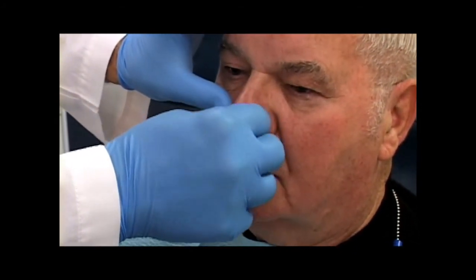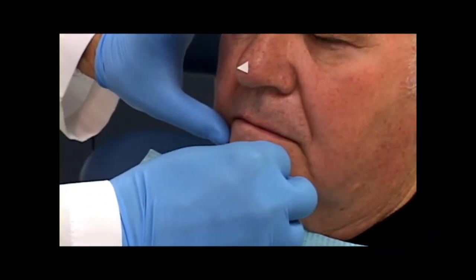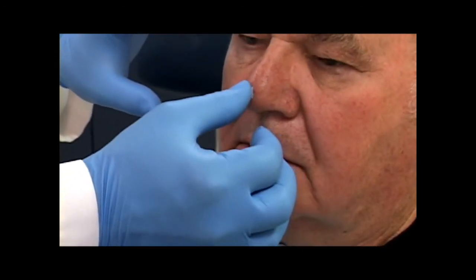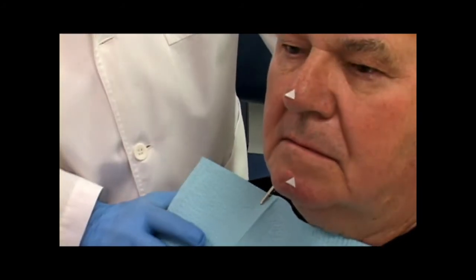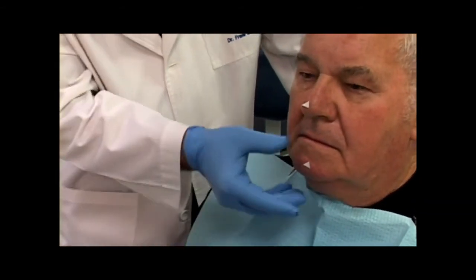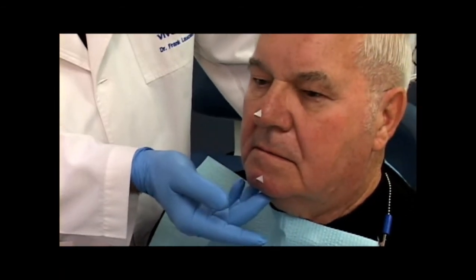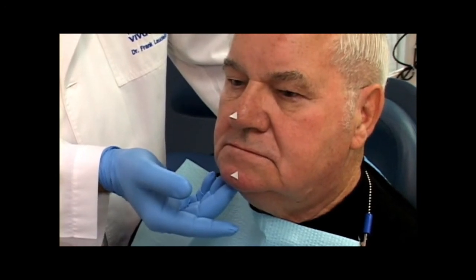The clinical demonstration will show the first mentioned technique. Adhesive triangles are placed on the patient's nose and chin to be used as reference indicators. The points of the triangles make a very distinct reference point and are much easier to remove than a pen or pencil marking. The patient's head is brought forward from the headrest. The patient is first evaluated with their existing dentures in place. As was evident with this particular patient, the vertical dimension is significantly overclosed.